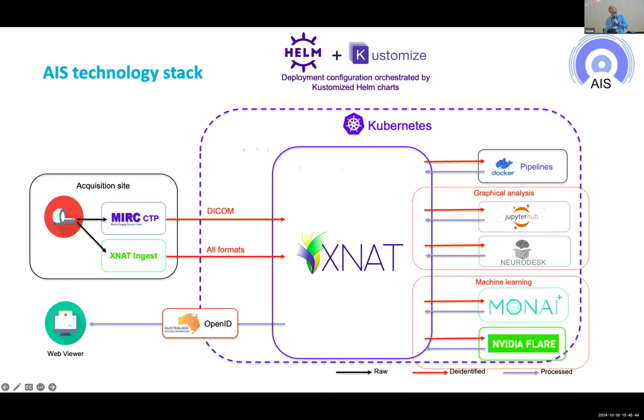On the acquisition side, we have the Medical Imaging Resource Center Clinical Trials Processor or the XNAT ingest package that we've developed, which do initial sorting of the data, so it goes into the right project on XNAT, and also de-identifies and securely transfers over the internet to the typically cloud-based repository.